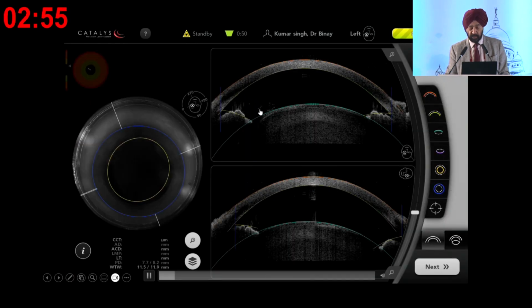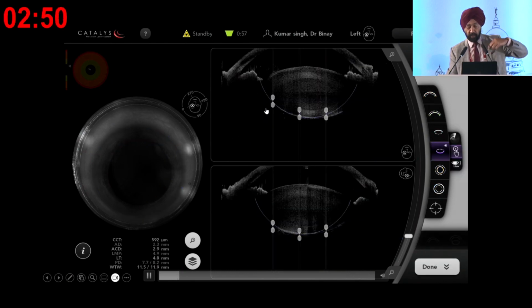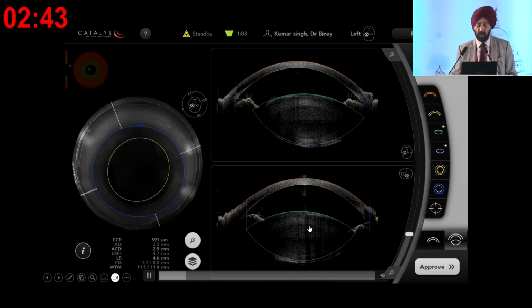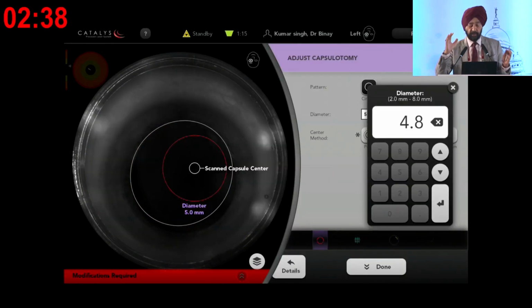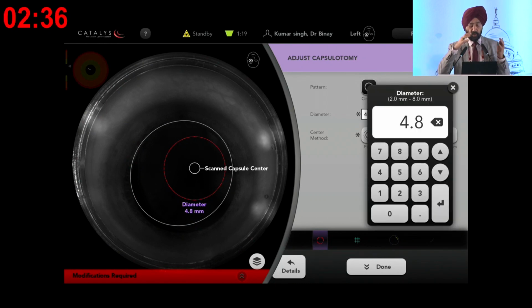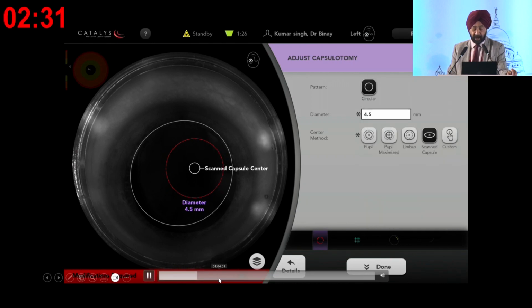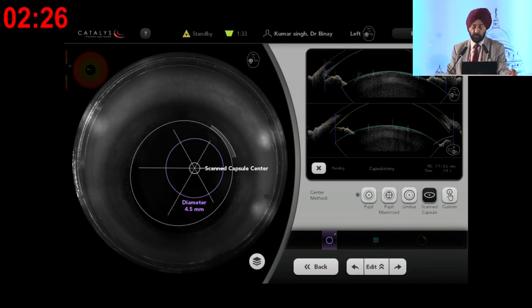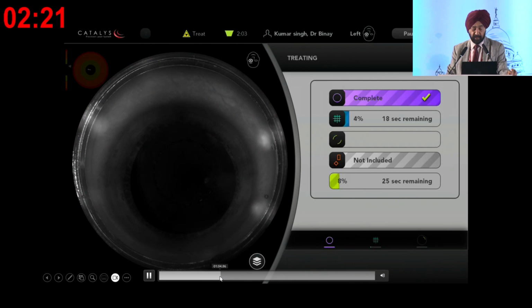Just see here, this is all vitreous. Can you make it out? The iris is going down. We have to readjust the posterior and anterior part of the capsule, because this is important to get a good capsulotomy where you want. Because you are going to put a ring, you can do a custom-made capsulotomy and increase its size so that once the CTR pushes the capsule to one side, it is central. So you can see this is a customized access, and we are increasing the size.